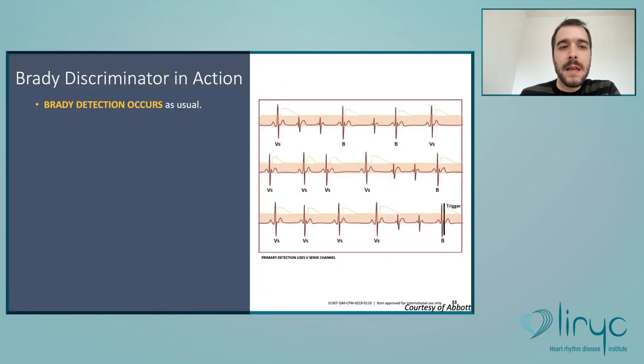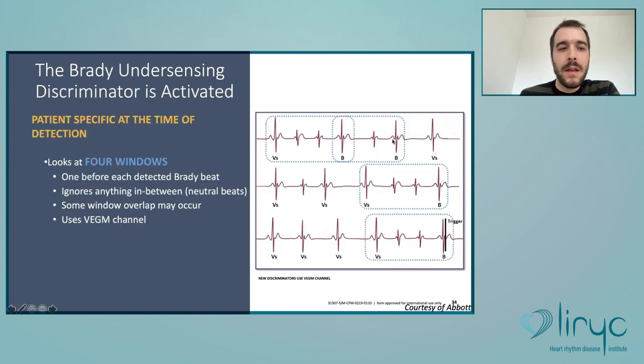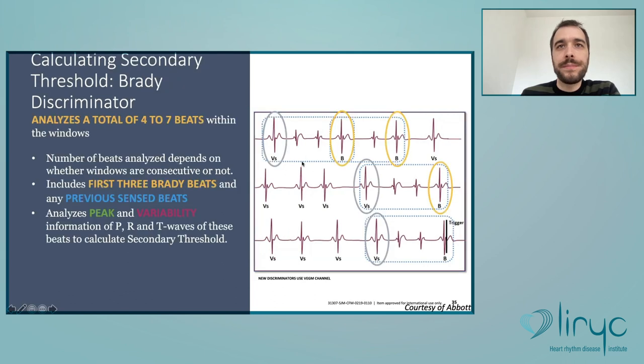undersense beats present. So for example, here the Brady detection occurs as usual with the detection of 4 Brady cycles. Here are the cycles labeled as B. So the device looks at 4 windows, 1 before each Brady beat. It will ignore anything in between. There can be some overlap in the windows. And to do this analysis, it will use the VEGM channel.